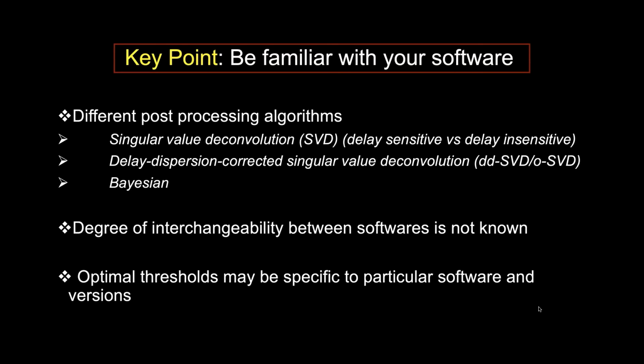What is the algorithm that's being used? You should definitely talk to your radiologist, because they will understand at the back end what kind of algorithms are being used. And the optimal thresholds may be specific to particular software and versions.